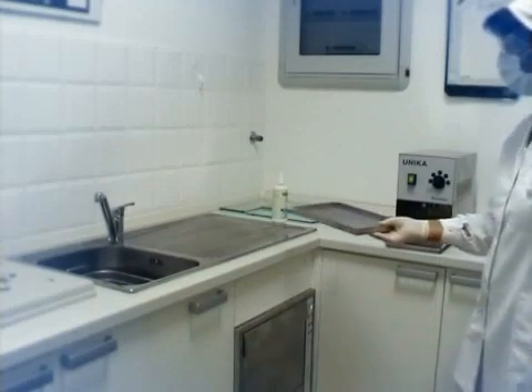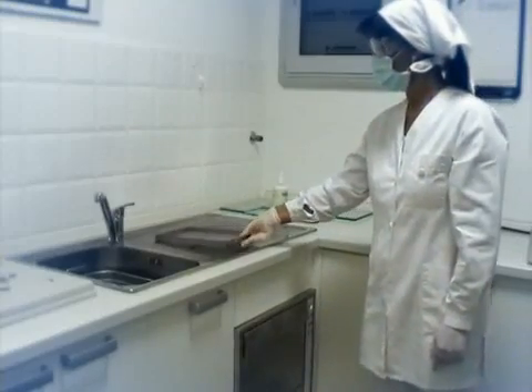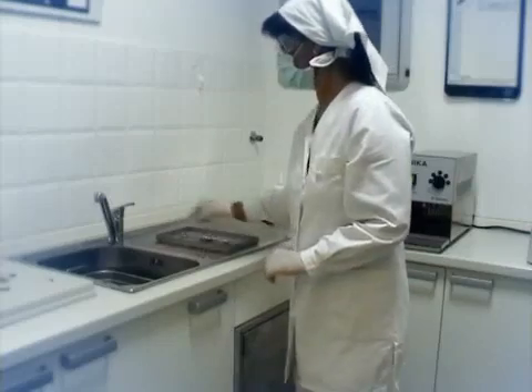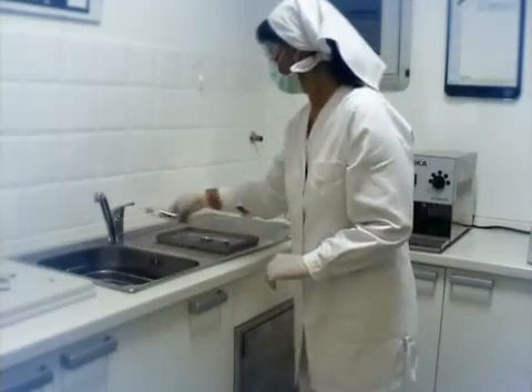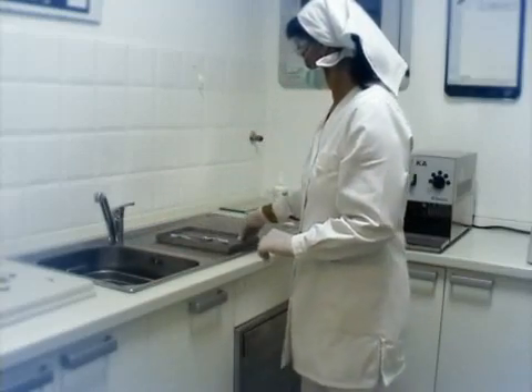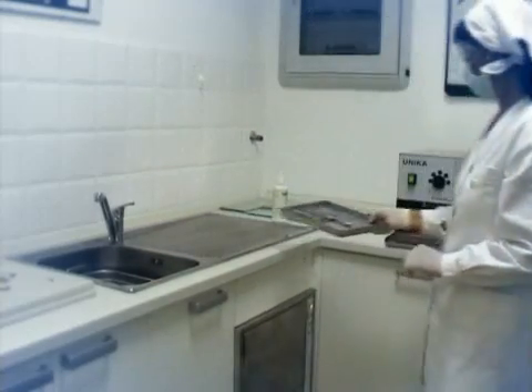Drying is an extremely important phase to ensure efficacious sterilization. Today, this phase is implemented manually using paper towels. This, however, places the operator's safety at risk, as the instruments handled are often sharp or pointed.